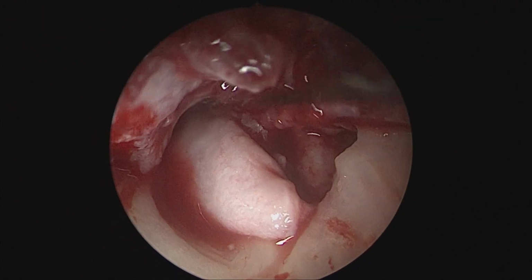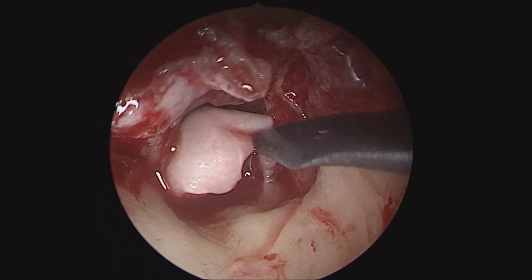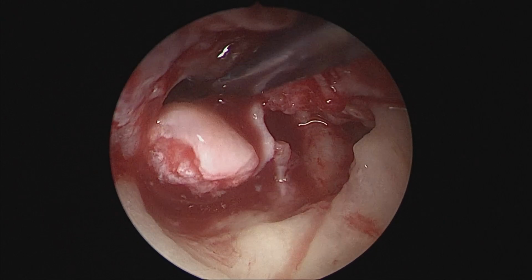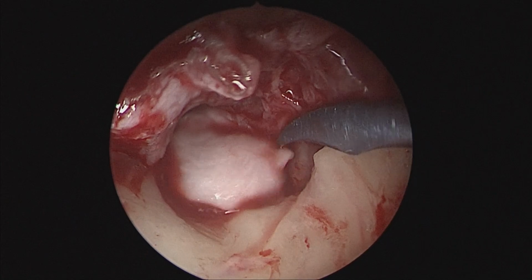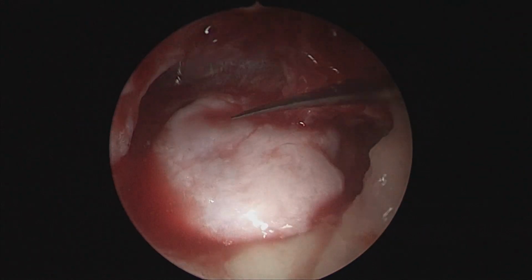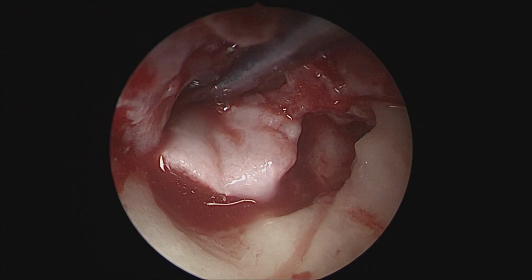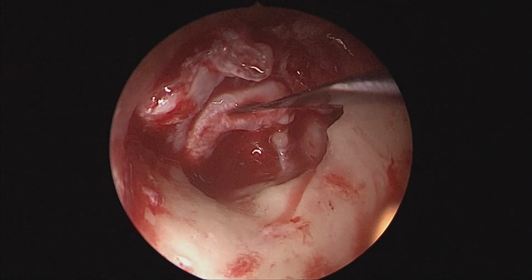So in case of some difficulty, one could use two hands by letting an assistant hold the endoscope, while the lead surgeon can use two instruments as well to place the graft anteriorly, or sometimes with a sickle knife it might just happen normally like such. So the thick perichondrium graft has already gone medial to the anterior tympanic membrane remnant. The endoscope also helps us to see in the recesses that there should be no part of it lateral to the TM remnant, so that no squamous epithelium is buried anywhere inside the middle ear.